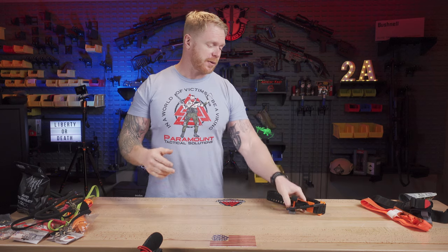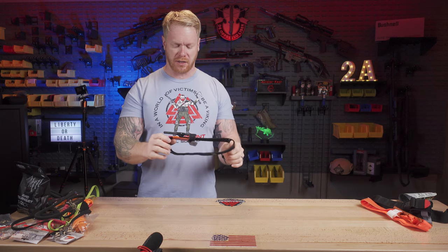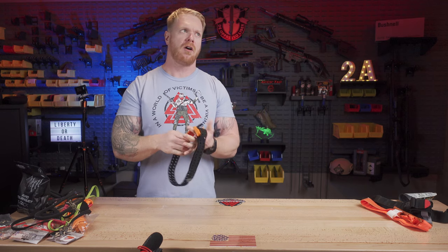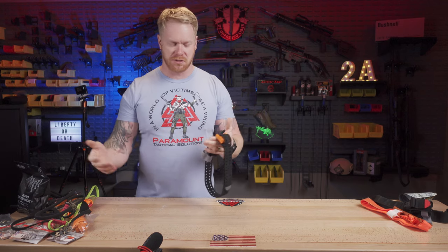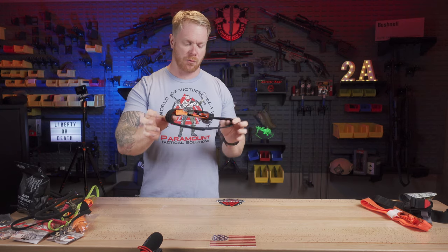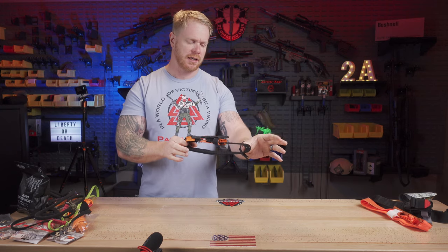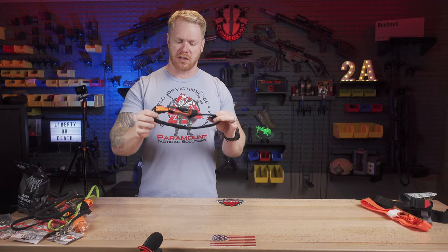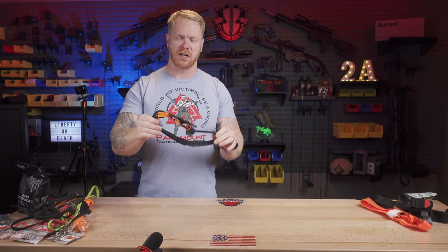Moving on, let's talk about the SAM XT tourniquet. This is a pretty innovative tourniquet with a lot of cool features. All tourniquets have pros and cons, but this one I really like. It's a fairly new tourniquet — only been on the market for a couple of years — and it covers a lot of the shortcomings of very similar tourniquets.